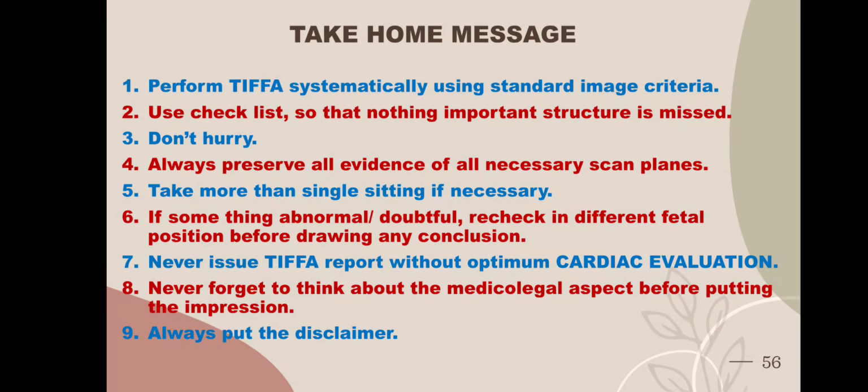Before concluding, let us summarize the most important learning points. First, always perform the TIFFA scan systematically using standard image criteria. Second, always use a checklist. Third, never hurry. Remember that a few extra minutes spent during scanning may prevent a lifetime of regret from a missed anomaly. Fourth, preserve adequate documentation of every mandatory image plane.